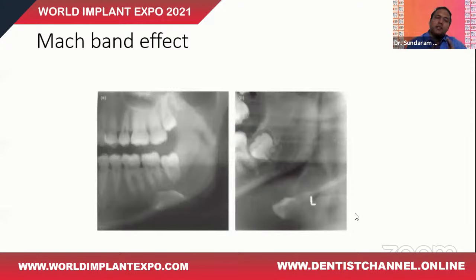And now the problem can happen with the radiographs, and there are some acceptable and well-documented problems that can happen with the perceptor, that is the clinician or the operator, whomever is interpreting the radiographs. So once the optimally made image is viewed under optimal conditions by a trained and experienced clinician, that image should be optimally interpreted. Unfortunately, physiological phenomena with each clinician may exert their influence. The Mach band effect is ubiquitous in radiology and occurs at the junction of two regions of different radio density.